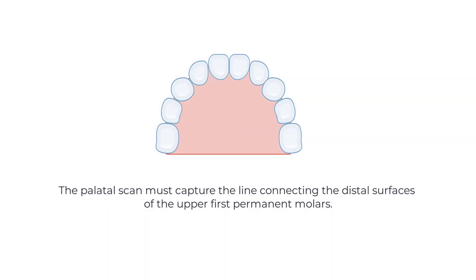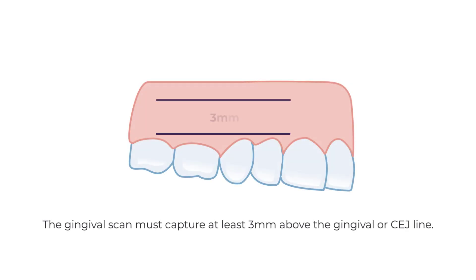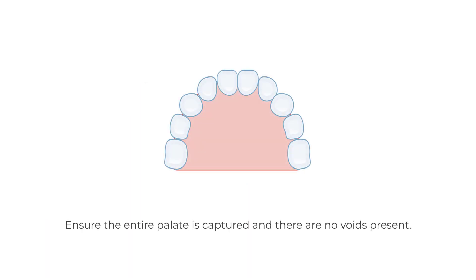The palate scan must capture the line connecting the distal surfaces of the upper first permanent molars. The gingiva scan must capture at least 3 mm above the gingiva or CEJ line. Ensure the entire palate is captured and there are no voids present.